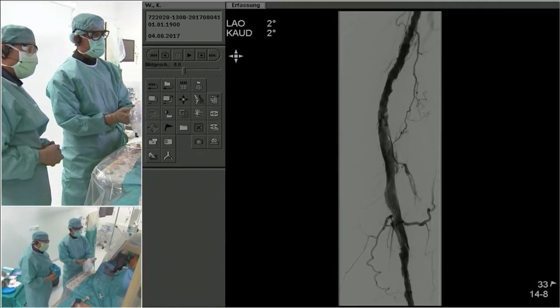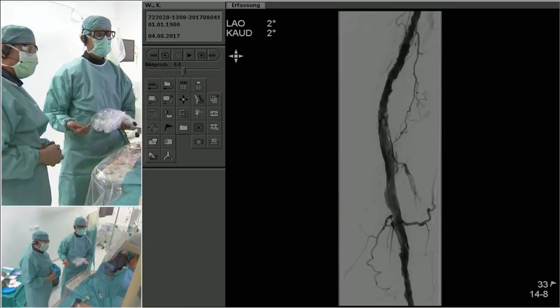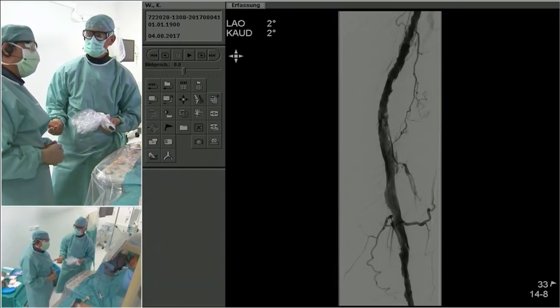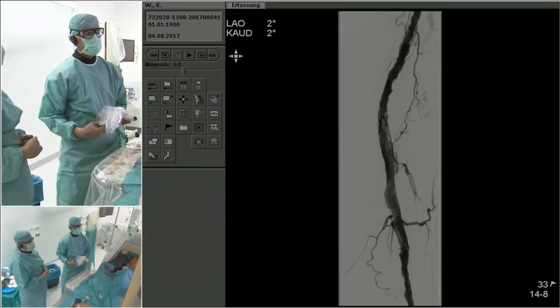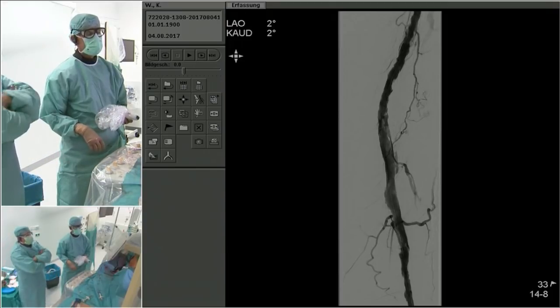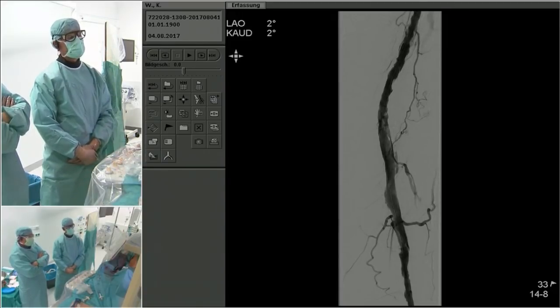I mean, it is not so bad. Definitely, I would continue with treatment. I mean, if another view shows a similar result, honestly, I would probably just do DCB and leave it alone and do surveillance, and you can always come back and put a scaffold another day. I'm surprised. I would have thought up front you would have needed the woven nitinol stent, but right now you've done remarkably well. So Andrej, did you get that?